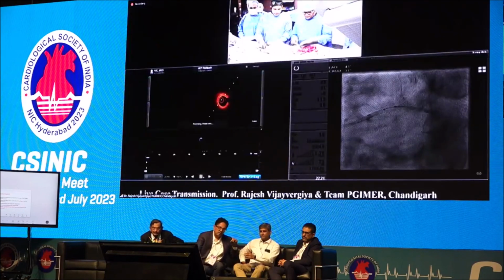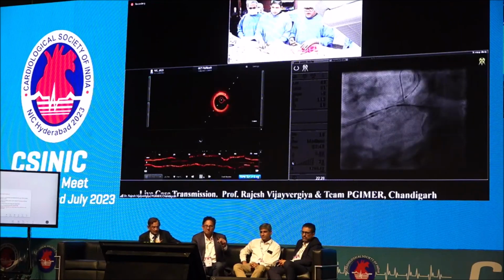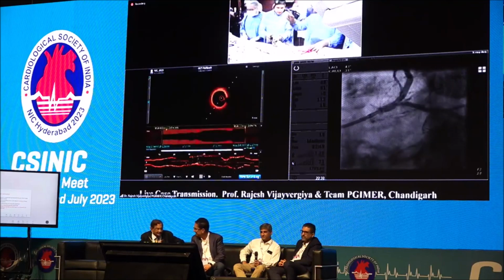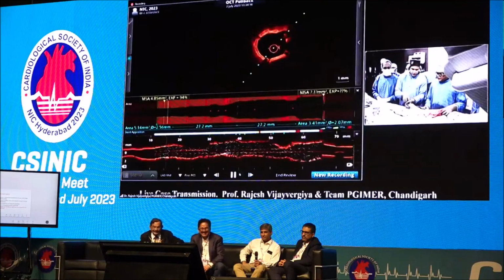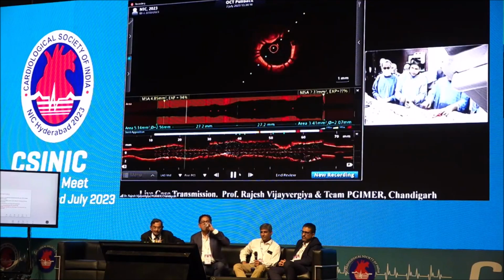Okay, Raj, we have about a minute left maximum. Okay, fine. So let me finish it off completely. Can you see the OCT run? Kindly display the OCT run of the LAD. 8, 10, 12. Very nice.